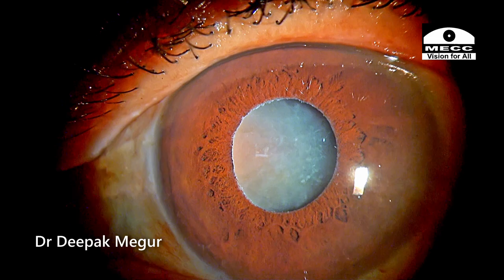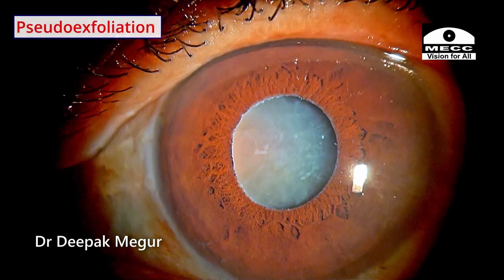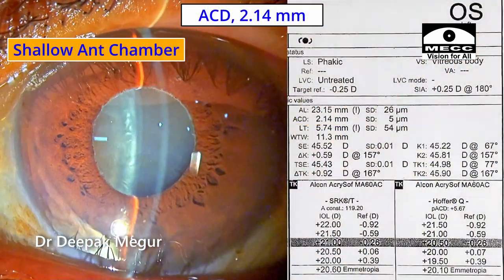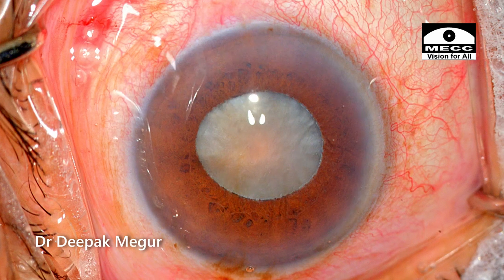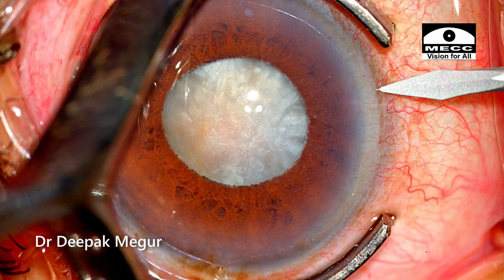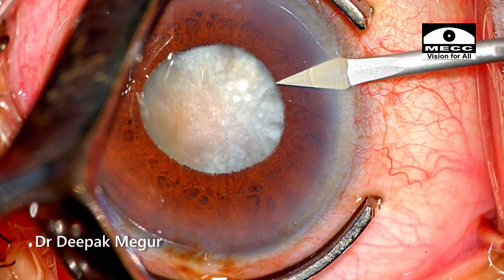Hello. Let me take you through this challenging case. An elderly lady with pseudoexfoliation, poor mydriasis, a hypermature cataract and a shallow anterior chamber is posted for surgery. The eyes with pseudoexfoliation with shallow chamber have the potential of having weak zonules as well. Well, in this case, the shallow chamber could be just because of the intumescent cataract as well. Let's see how things go.